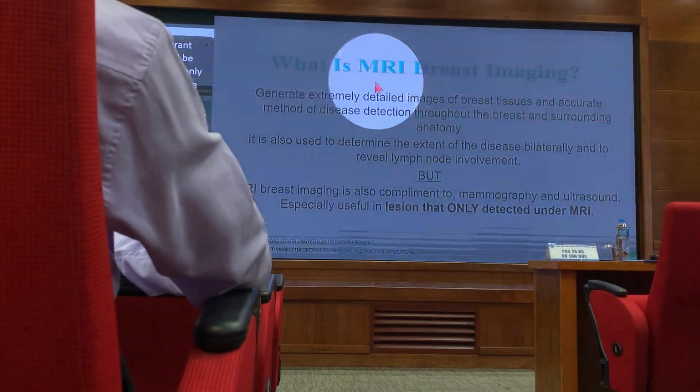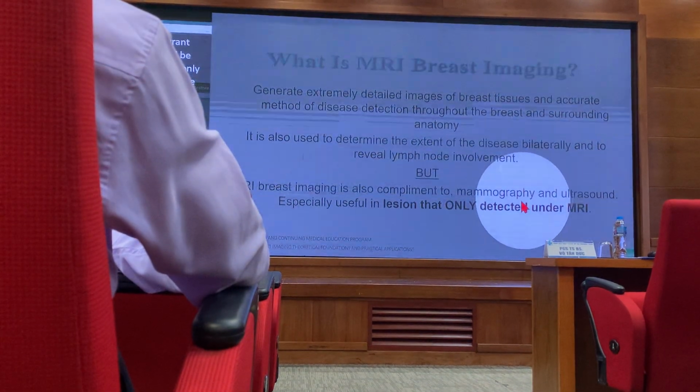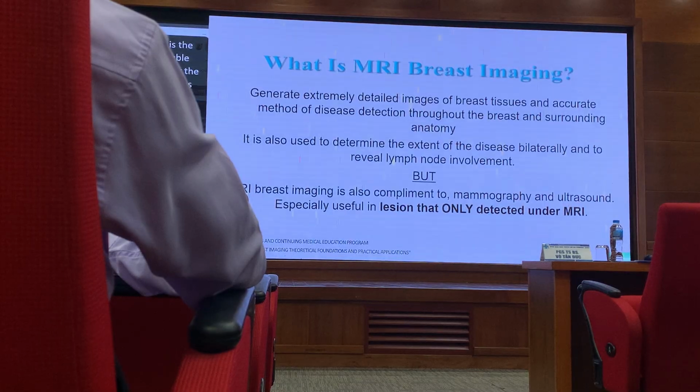MRI will be very useful for lesions that are only detectable under MRI, because they are unable to be seen under the ultrasound and mammogram, right? We have no choice for that.